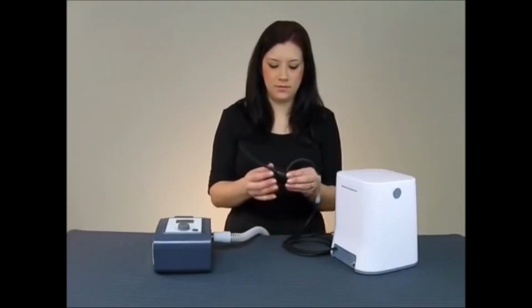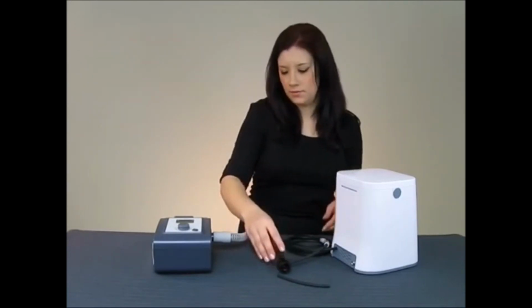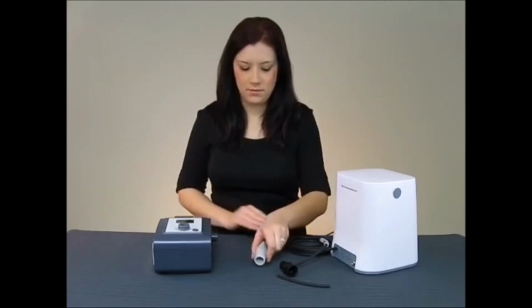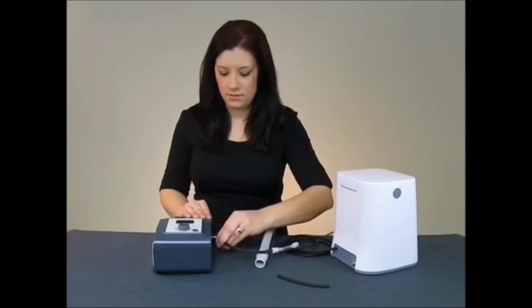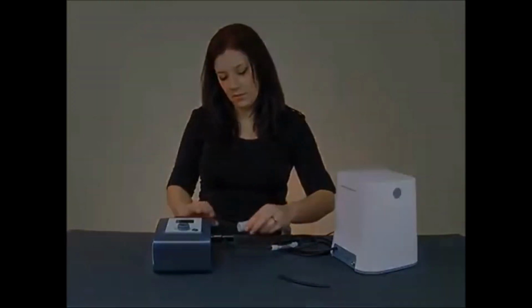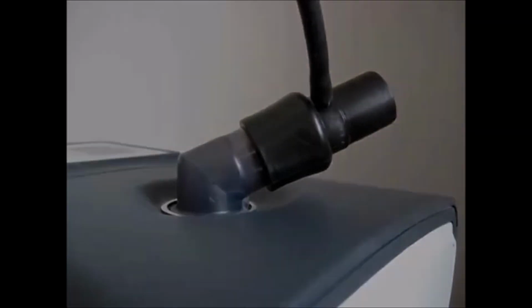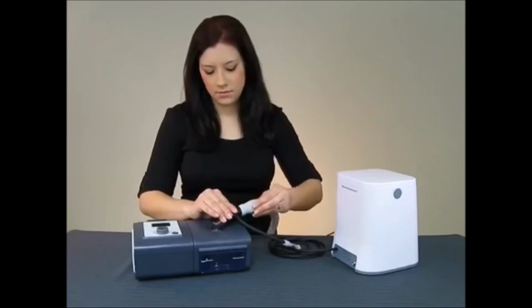If your CPAP unit has no humidifier, remove the short length of black hose from the plastic fitting by pulling it straight out. Then, place the fitting onto your CPAP machine in the spot where your CPAP hose once attached. With your fitting now connected, you can reattach the main CPAP hose to your unit, only now it attaches to the end of the SoClean fitting.